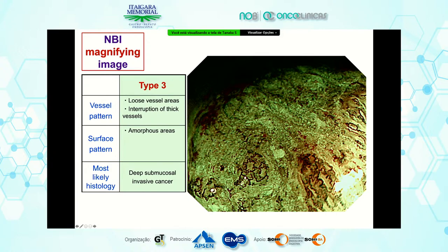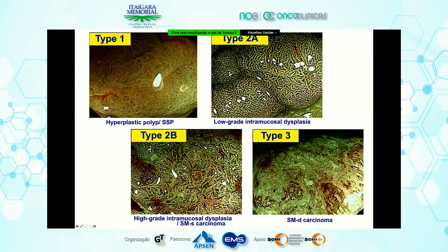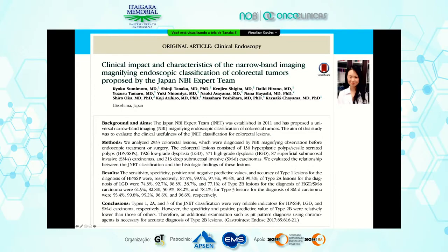Vessel and scattering vessel. Please see this slide: type 1, type 2A, type 2B, type 3. You can understand this definition. My colleague estimated the clinical significance of the JNet classification.